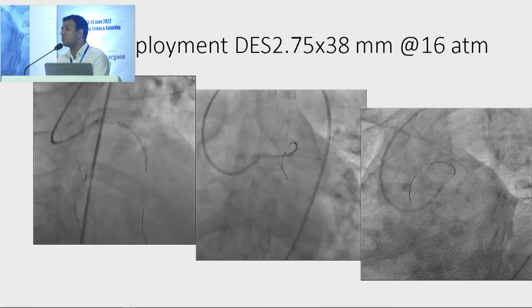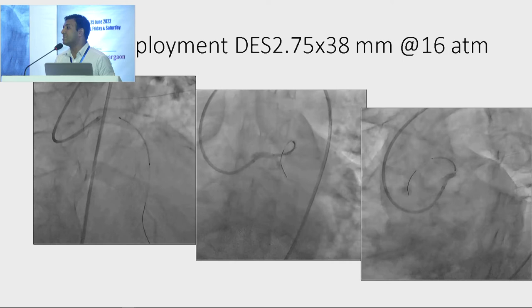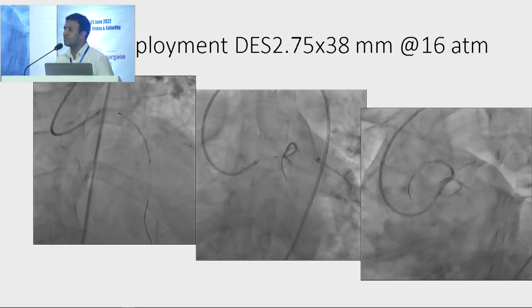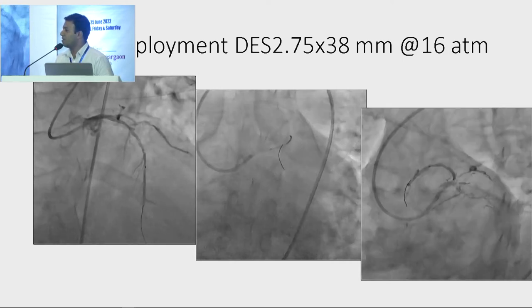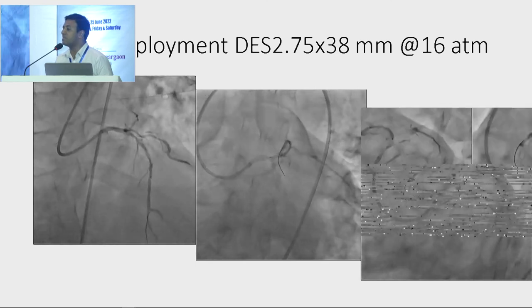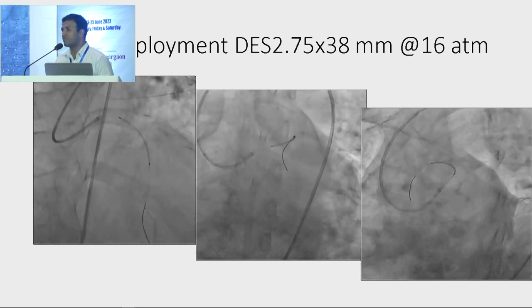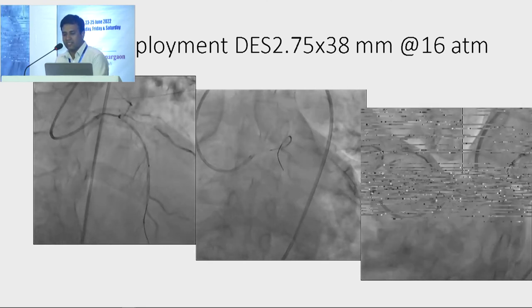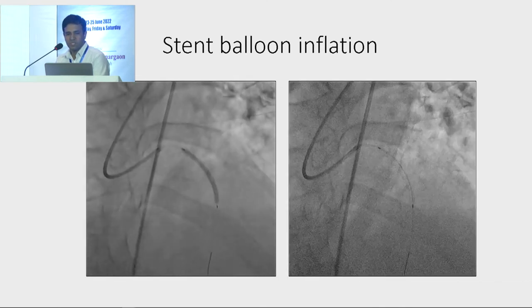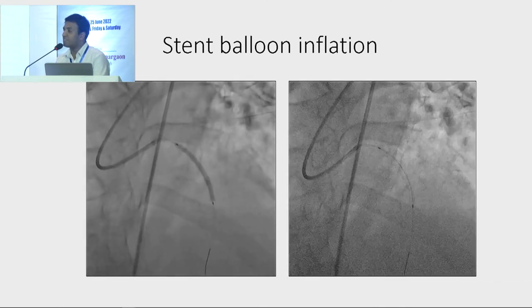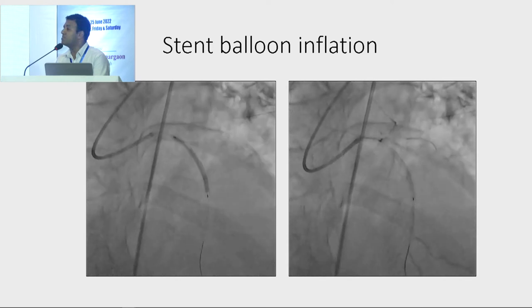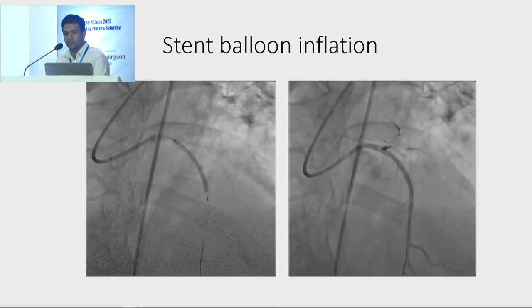According to OCT calculation, the lesion length was 35.5 mm. So we placed one stent — 38 mm in length and 2.75 mm in diameter — deployed at 16 atmospheres. We inflated the stent balloon and you can observe that TIMI 3 antegrade flow was achieved.